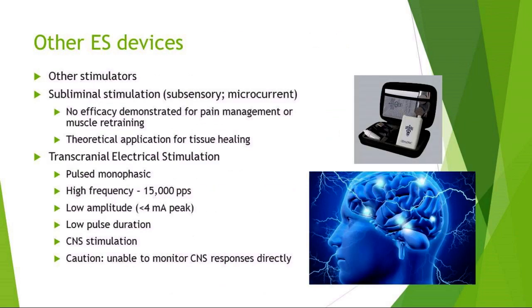So lots of other electrical stim devices, and we will have a bunch of different ones that we will play with in the lab, so you can try different things and compare how they feel, and maybe develop your own preferences for the ones that you like. And then every clinic you work in, you're going to have different devices as well. So you'll get used to that, but what I really want you to get out of this class is that you can take any electrical stim device and make it do what you want. You are going to be knowledgeable enough to do that. That's my goal.